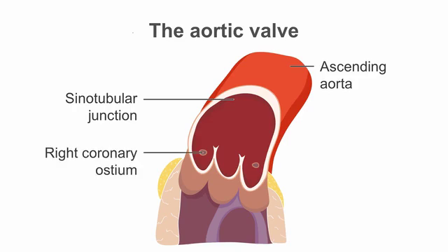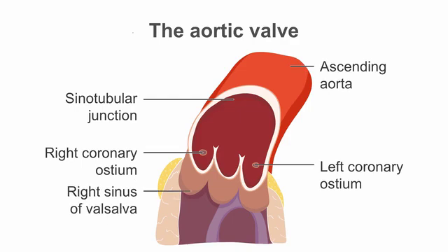Below the sinotubular junction, we can see the right coronary ostium and the left coronary ostium arising from the right sinus of Valsalva and the left sinus of Valsalva respectively. The sinuses of Valsalva represent the area immediately superior to all three of the aortic valve leaflets.